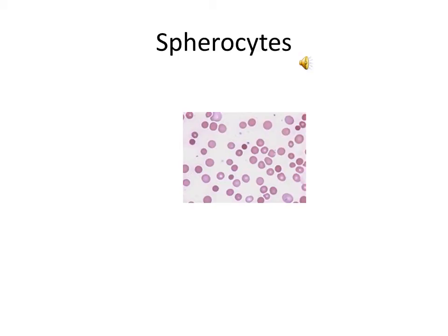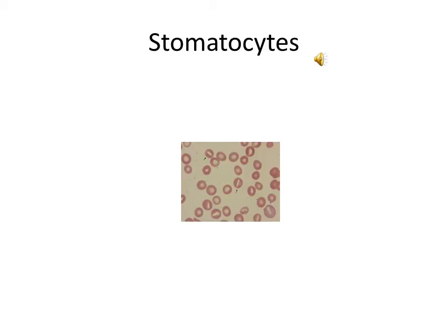Spherocytes do have an increased osmotic fragility. Please note that burn victims can have microspherocytes, as you see in this slide. Stomatocytes are a result of a membrane defect. Stomatocytes derive from the Greek word stoma, which means mouth. Their area of central pallor looks slit-like or mouth-like on peripheral blood smears. They're normal size, but they're not biconcave.